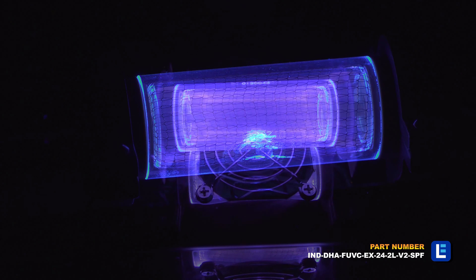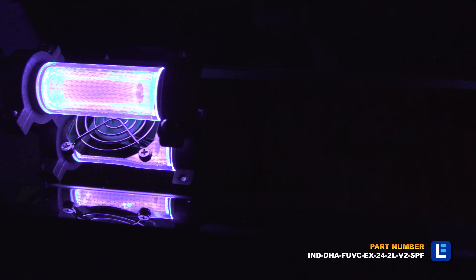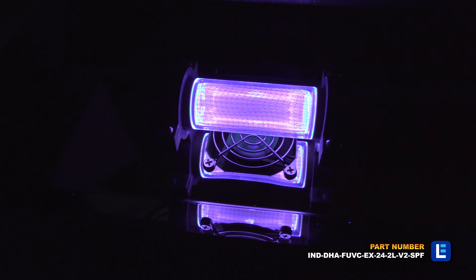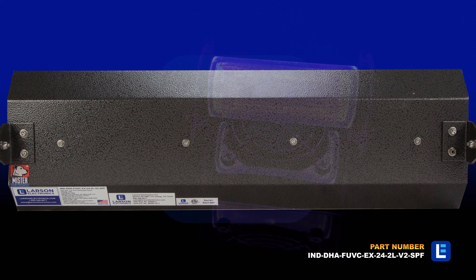Far-UV excimer lamps are the preferred choice for UV sanitation and disinfecting applications due to being safe for use in occupied areas, with lamps that are instant-on power, mercury-free, higher UV output, and low heat output.